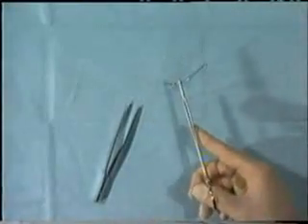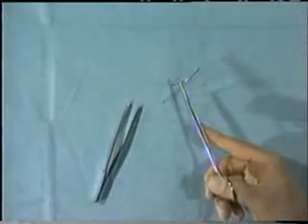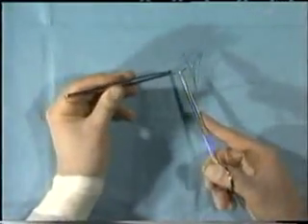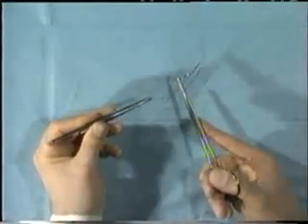When picking up needles, use the needle holder, and then if you wish to alter the position of the needle in the needle holder, don't use your fingers, use the forceps to hold the needle and reposition it. Also be careful when tightening sutures that the needle does not do damage outside your field of vision.